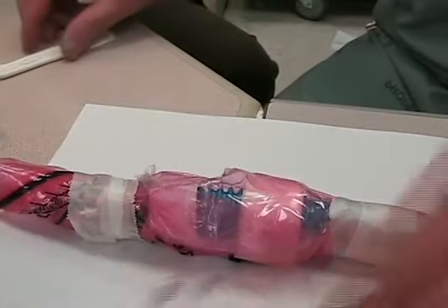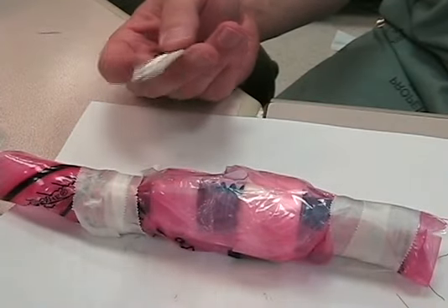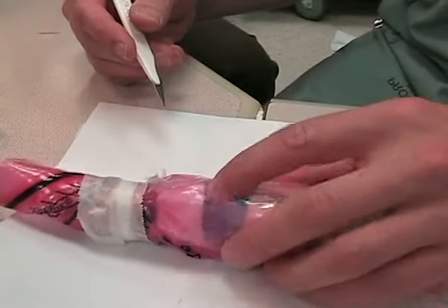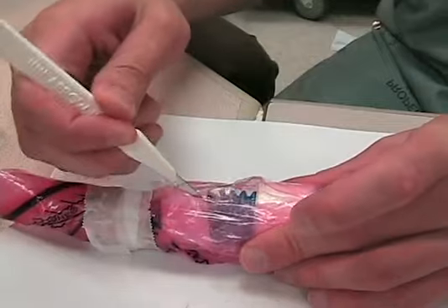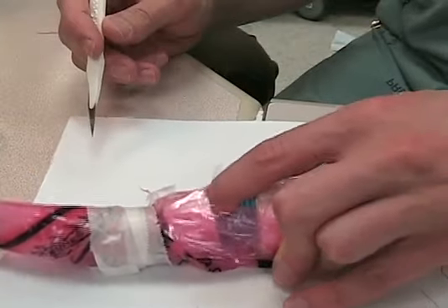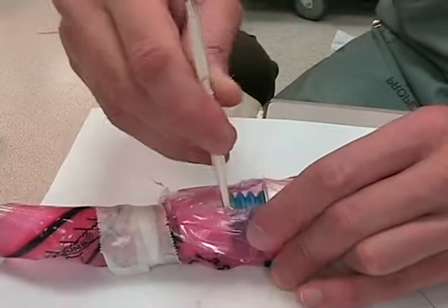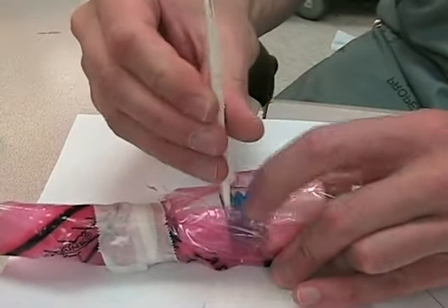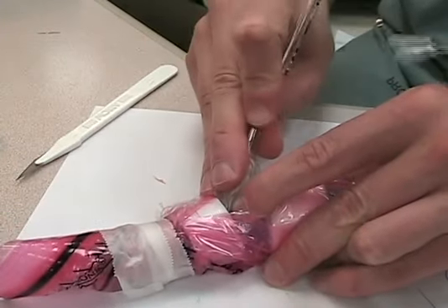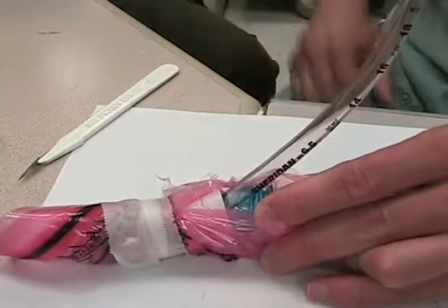Last thing: what do you do if you have no equipment? You still need a scalpel — hopefully an 11 blade, but whatever you have. This is a crash crike. Find the membrane with your finger, make a nice big skin incision, find the membrane again, horizontal incision through the membrane, get your finger in there, then take the back of the scalpel handle and get it in the hole. Take your finger out, turn the scalpel handle to widen the hole, get your finger back in, take your tube, insert horizontally, orient now vertically, and jam it in.